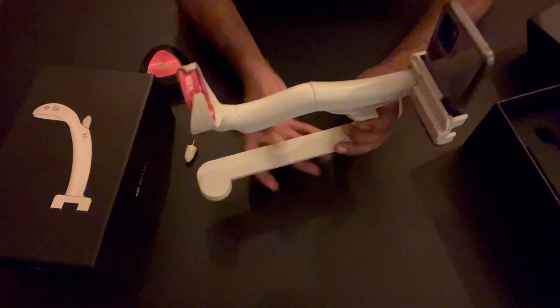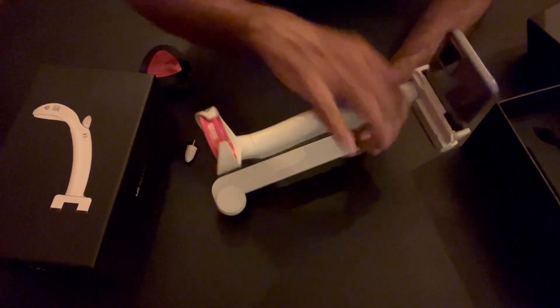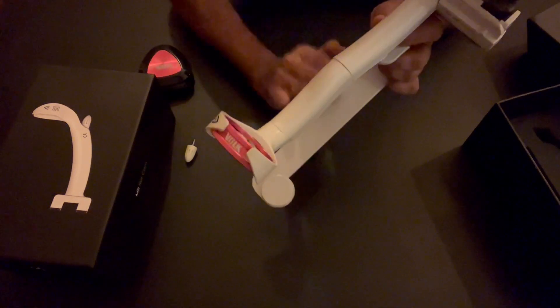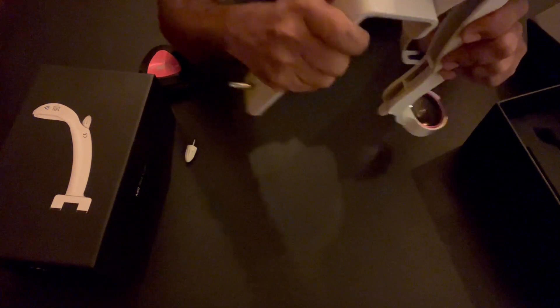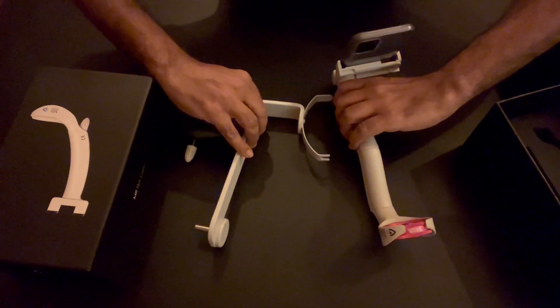So now you know how to assemble the entire handheld device and how to place it on the slit lamp mount. If you want to remove it from the slit lamp mount, remove the lower portion first and then take it out. Thank you so much for watching.